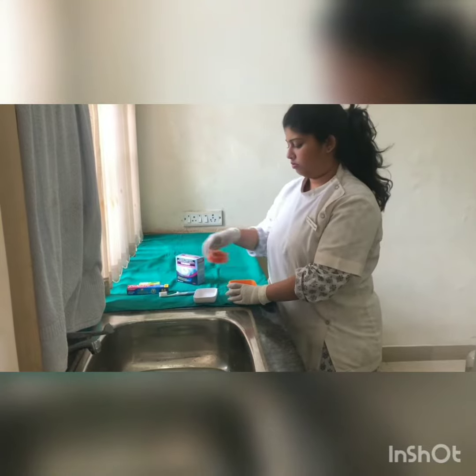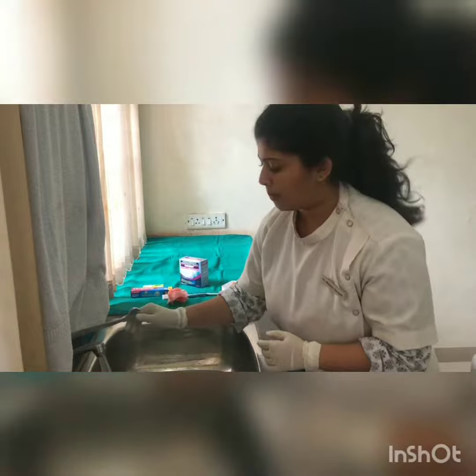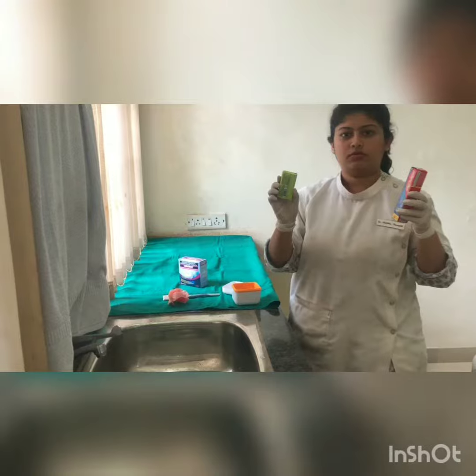Do not wash your dentures with hot water. Do not use any toothpaste, tooth powder, or washing powder to clean the dentures.